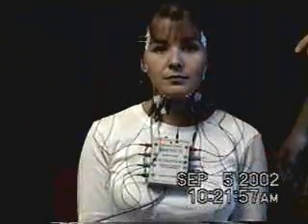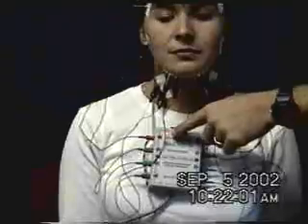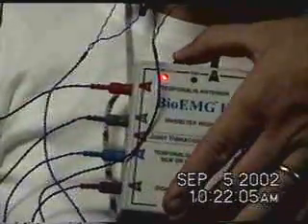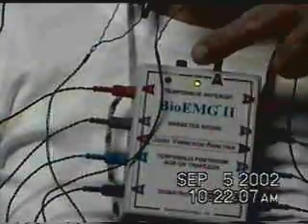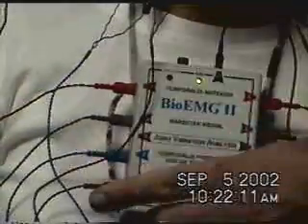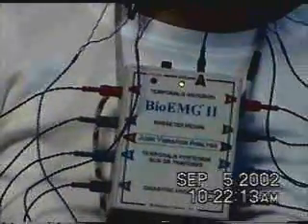The last thing we need to make sure of before we begin to record electromyography is that we switch from JVA only to EMG. By pressing this button on the top of the amplifier box right here, we now illuminate the EMG light, and all of these channels are open and ready to record electromyography.